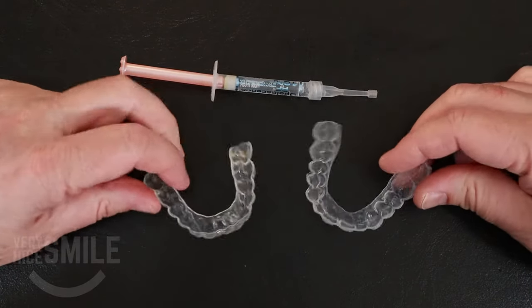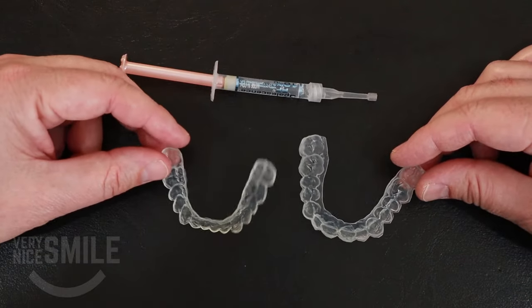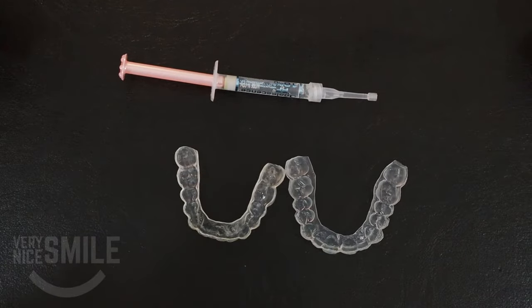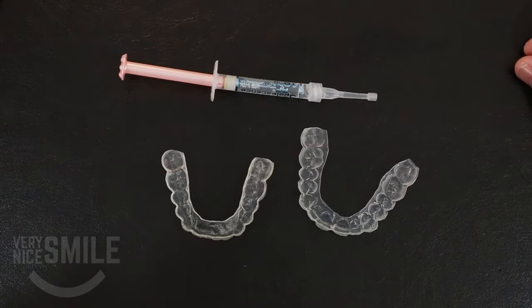I don't even want to tell you how long I've had these trays for — I'm going to guess it's probably getting close to 20 years. It's not something that I use every day. I used them in the beginning to whiten my teeth and now it's just a matter of touching it up one or two days a month.